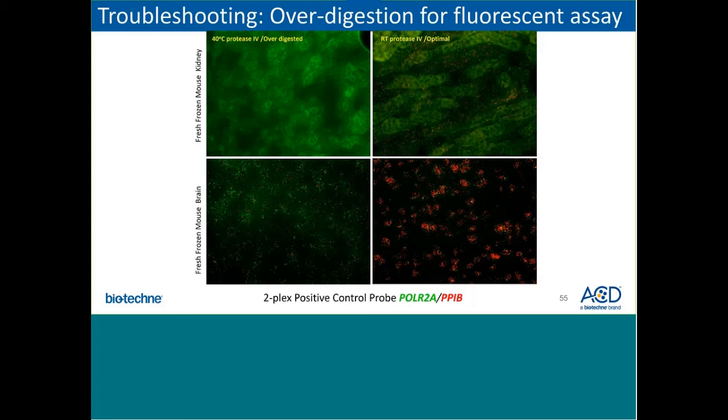On the left, protease digestion is performed at 40 C, so the tissue is over-digested, and not only do you not have any punctate signal, but you also see an increase in the background. On the bottom is the fresh frozen brain sample. With properly treated samples, there is no background and beautiful punctate signals. And again, with tissue over-digestion, we see an increase in background and a slight decrease in signal.